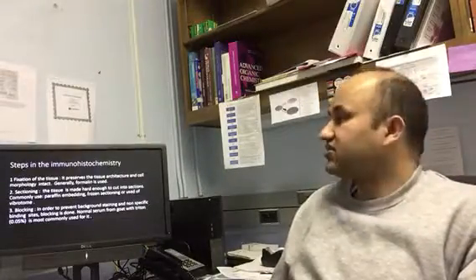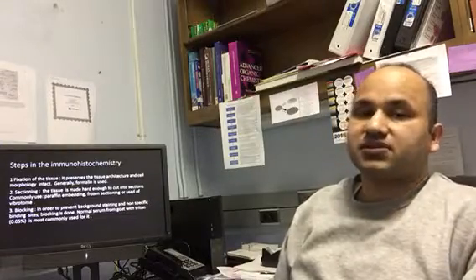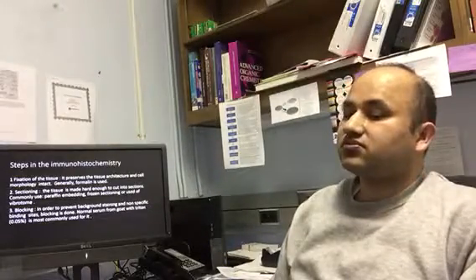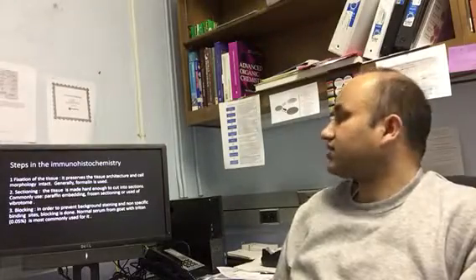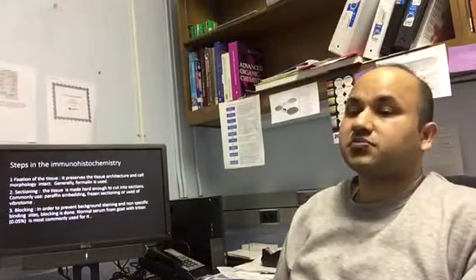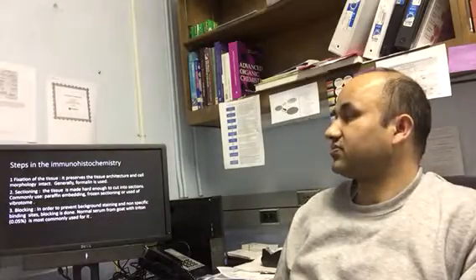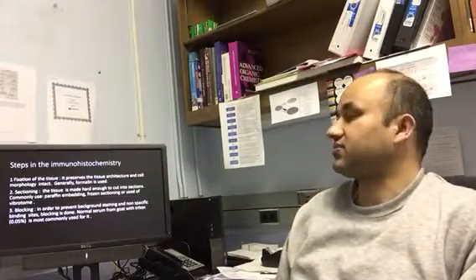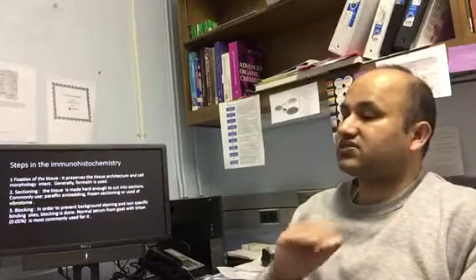Now let us talk about the steps in immunohistochemistry. There are basic steps which everyone follows. The first step is the fixation of the tissues. The tissue should be fixed first, because the tissue architecture and the cell morphology have to be intact. Formalin or paraformaldehyde solutions are often used for fixation of the tissue. The second step is that the tissue has to be cut into thin sections.